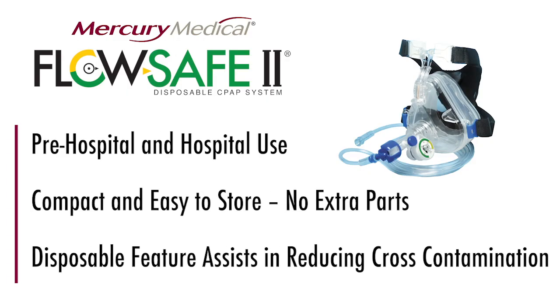As you can see with the FlowSafe 2, you can simply make all your adjustments. The mask is simple, easy to use, and very comfortable.